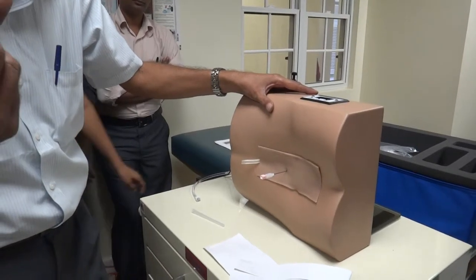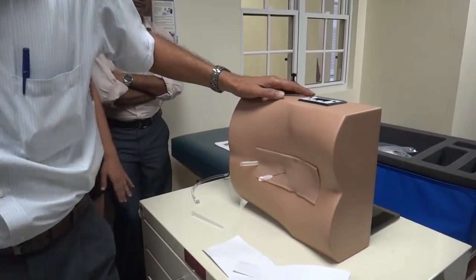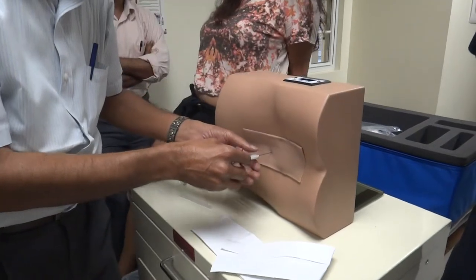You felt a pop. Did you hear it? Those of you in the back didn't hear it, perhaps. You will feel it, don't worry. Very subtle.